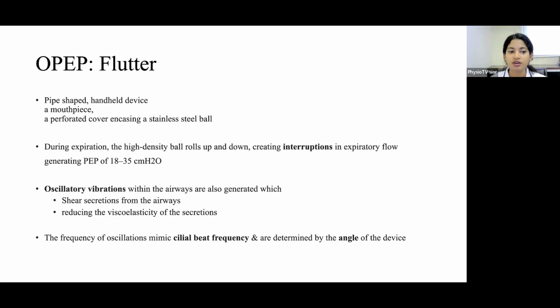And the PEP, or the positive expiratory pressure, that will be generated with this device would range from 18 to 35 centimeters of water. Okay, so what is the reason for generating an oscillatory vibration?